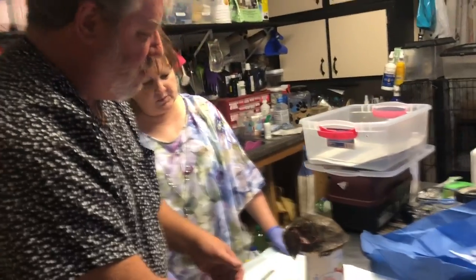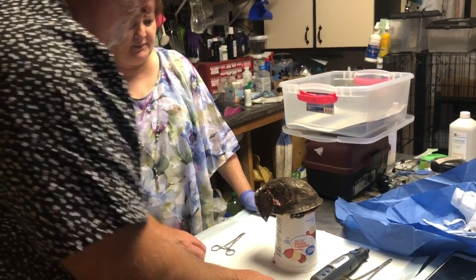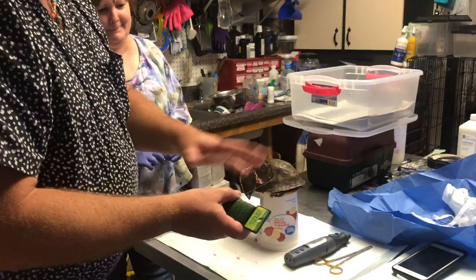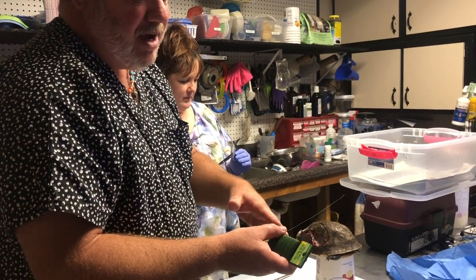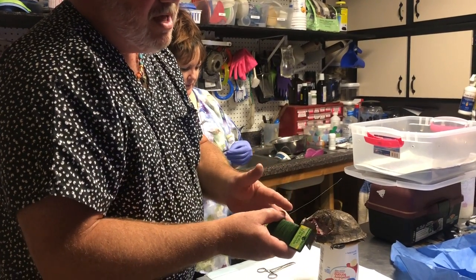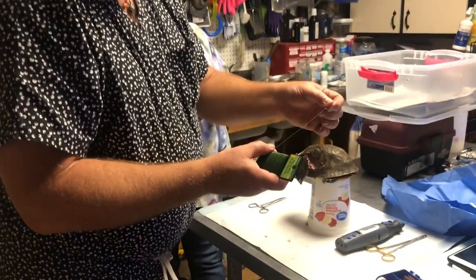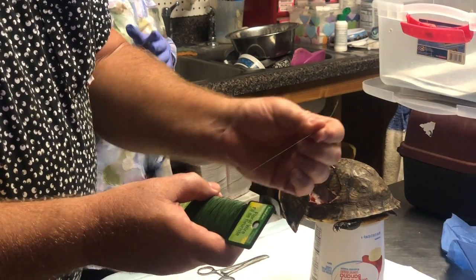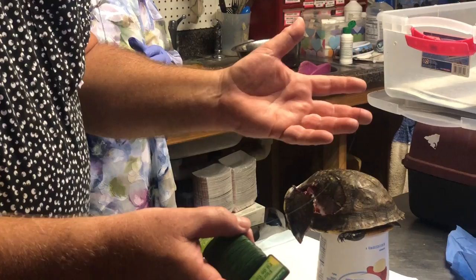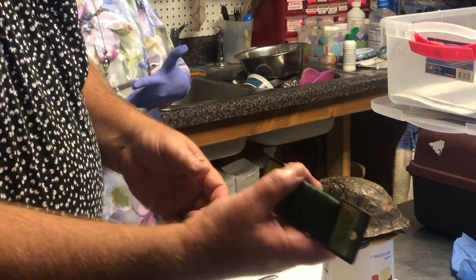That'll actually keep this guy alive. For decades — two decades to be specific — I have been using stainless steel wire in most of my patients, all of them. After looking at some older patients I see maybe 10–15 years later, I realized the wire is still there and sometimes even stunting their growth. So what I've started to do is use this floral wire, because it's biodegradable — it'll break down over time. It's very thin, strong enough, bends and twists well for wire suture, and over about a year it will break down and fall off the tortoise. Stainless steel will always be in there and be a nidus for infection. For you guys fixing tortoises that are going to be released to wildlife, think of this as absorbable suture.